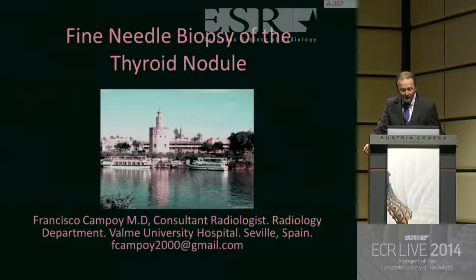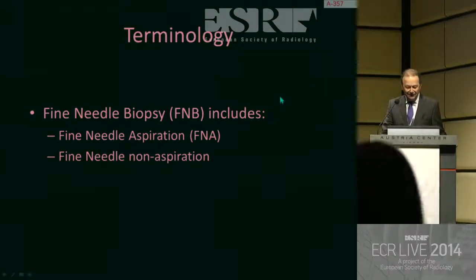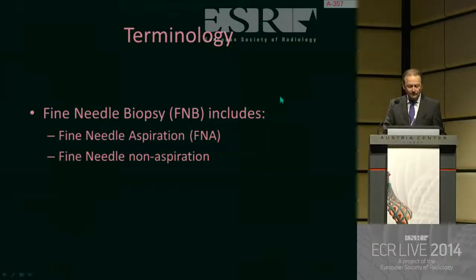Thank you very much. I will talk about fine needle biopsy of the thyroid nodule. And let me tell you that I prefer to say fine needle biopsy, FNB, instead of FNA, because the thyroid is so vascularized that most of the time the fine needle biopsy is going to be non-aspiration, so I prefer to say FNB.